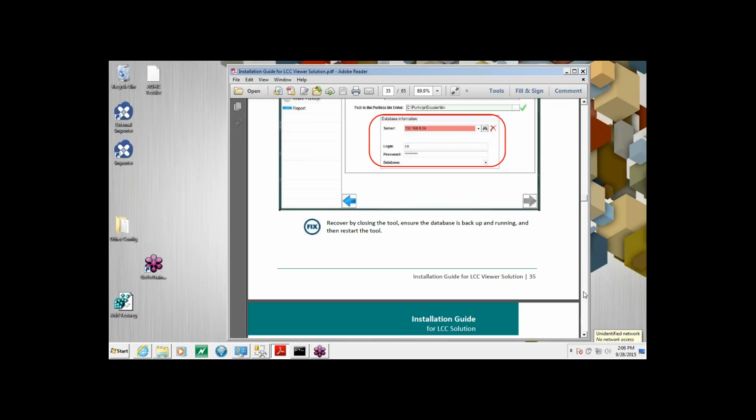Now there is a question on the advantage and disadvantage of going through Microsoft SQL Server or MySQL. The difference is license and tools. With Microsoft SQL Server, you cannot use the free edition because of the limitation of the database to 10 GB. Therefore, you need to at least purchase SQL Server Standard Edition. If you have charity pricing through TechSoup it is not that bad, but if you don't, it can be quite pricey.